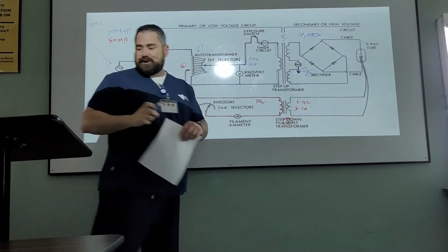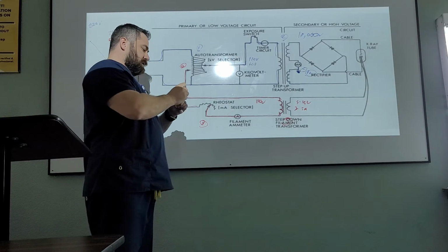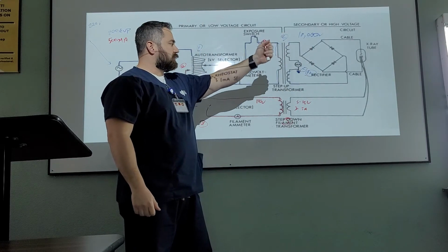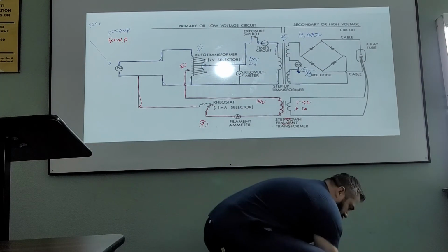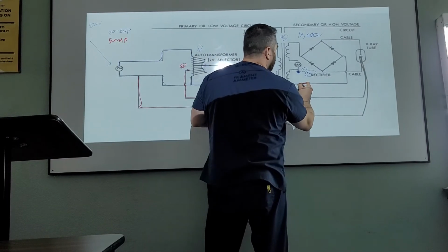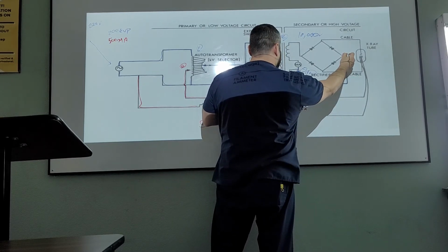The way the falling load generator is going to work is it is going to just drop 10,000 volts. So 10,000 volts, there's one. Another one, 10,000 volts, just like a water faucet, dropping and bringing them into the circuit here. And the way it's going to work into that circuit is coming from the bottom here. It's going to come on up this way.